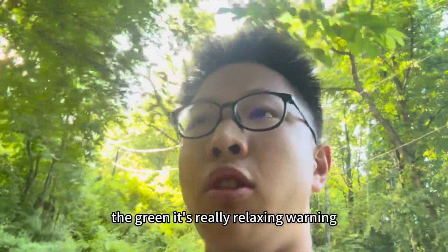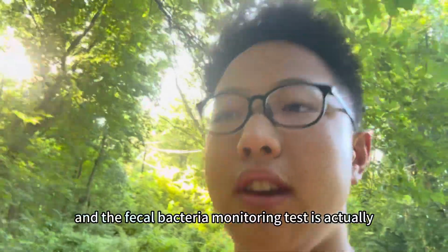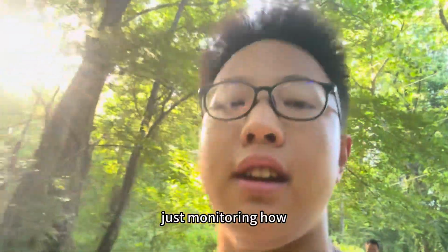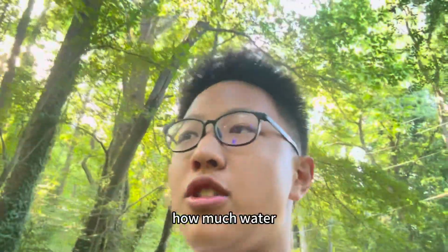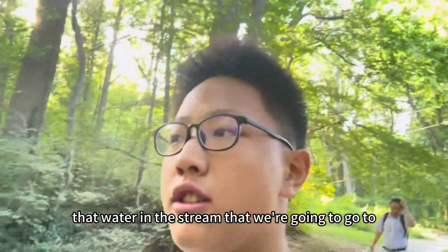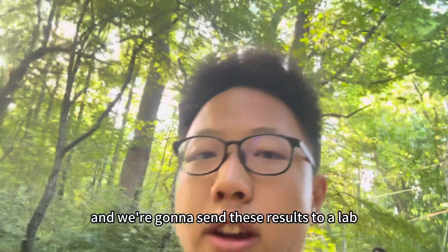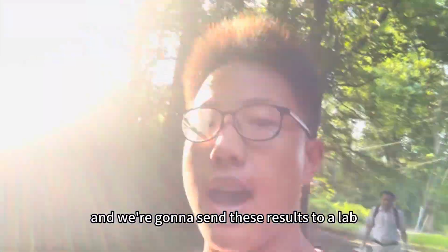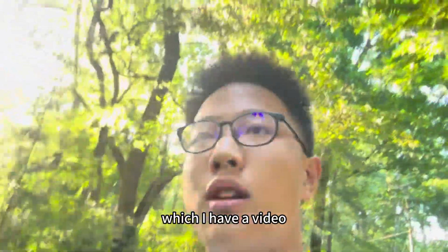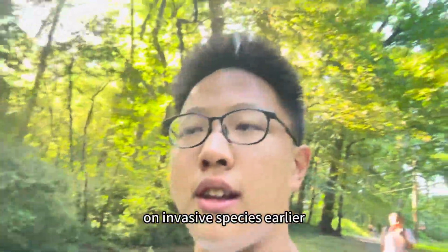It's a really relaxing morning, and the fecal bacteria monitoring test is just monitoring how much bacteria there is in the water in the stream that we're going to go to. And we're going to send these results to a lab. We do this with the Little Falls Watershed Alliance, which I have a video on invasive species earlier.